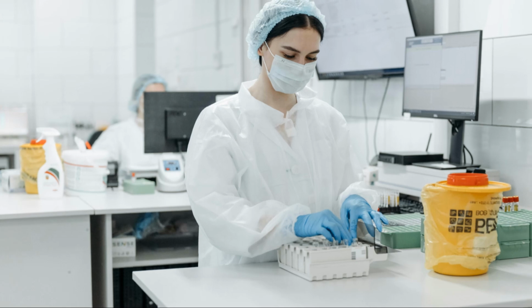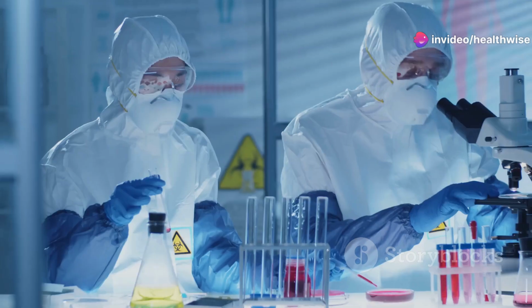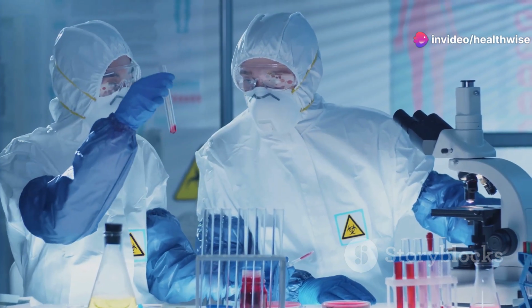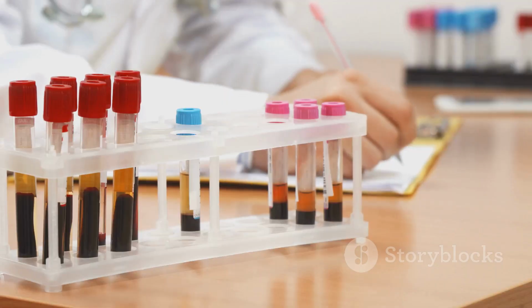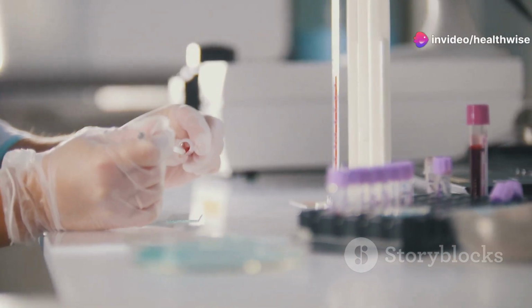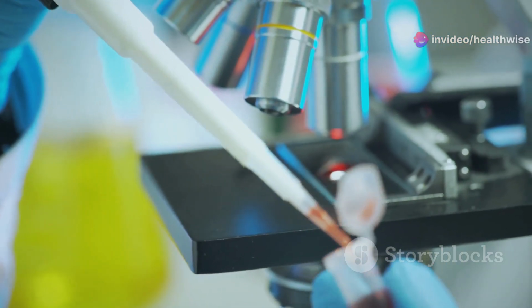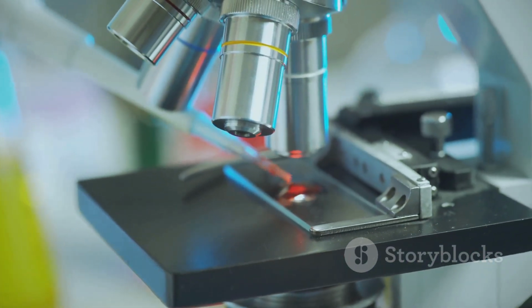Once collected, specimens need to be transported to the appropriate lab departments for analysis. This often involves placing the samples in biohazard bags and ensuring they are handled according to specific guidelines to maintain their integrity. Documentation at this stage is equally important. Each specimen's journey from collection to the lab is tracked to ensure there's no loss or contamination. This meticulous tracking helps in maintaining the chain of custody for the specimen, which is crucial for accurate lab results.